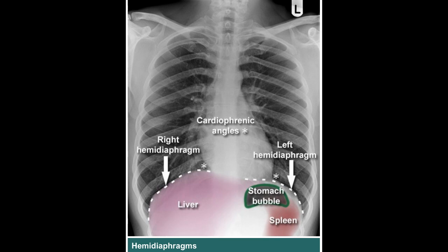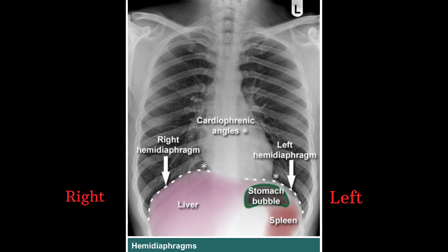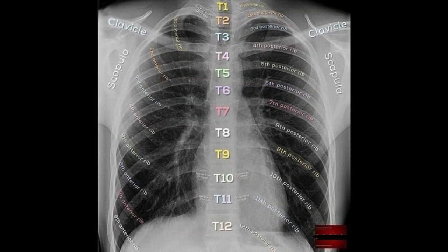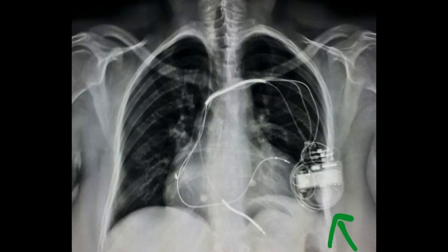Next, check the diaphragm. The right dome of the diaphragm should be slightly higher than the left. The costophrenic angle should be sharp, and there should be no free air under the diaphragm. For bones, check for any fractures in the ribs, clavicle, scapula, or spine. Soft tissue should be normal. In female chest X-rays, shadows of the breast and sometimes the nipple may be visible. There should be no subcutaneous emphysema and no foreign devices — though in patients with a pacemaker, the pacemaker leads will be visible on the chest X-ray.